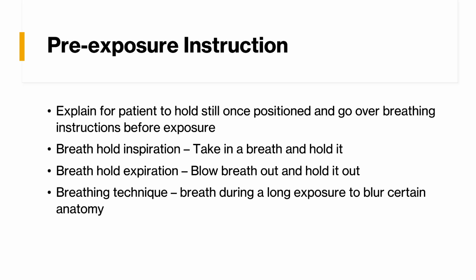Why do we do this? If we're taking imaging where we can see their diaphragms or they're breathing during a longer exposure, they can start to blur certain anatomy. When we're doing chest imaging, we want them to take a nice deep breath in and hold it during inspiration, because as they breathe in, the diaphragm's lower, so we can actually see more of the chest.